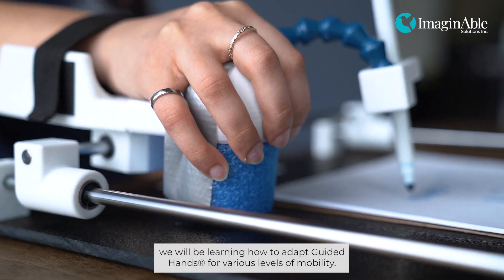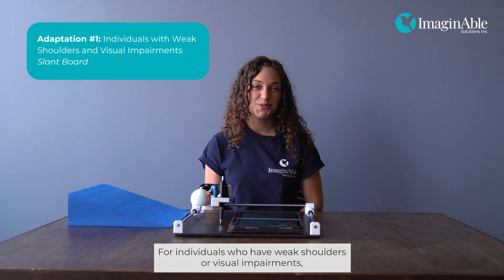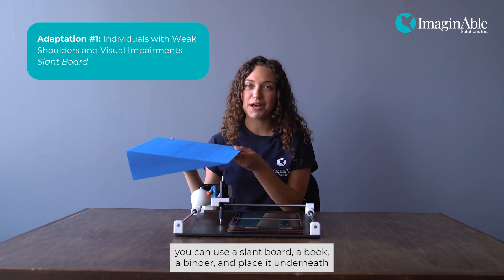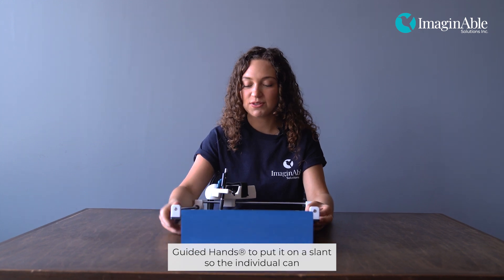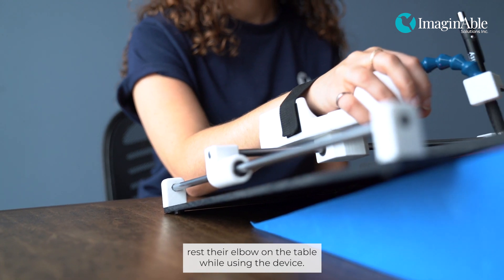In this video, we will be learning how to adapt Guided Hands for various levels of mobility. For individuals who have weak shoulders or visual impairments, you can use a slant board, a book, or a binder and place it underneath Guided Hands to put it on a slant so the individual can rest their elbow on the table while using the device.